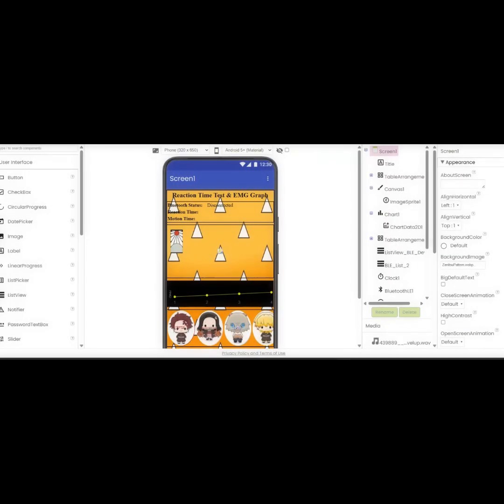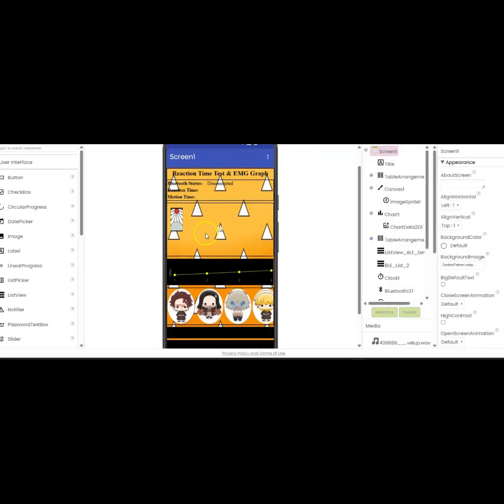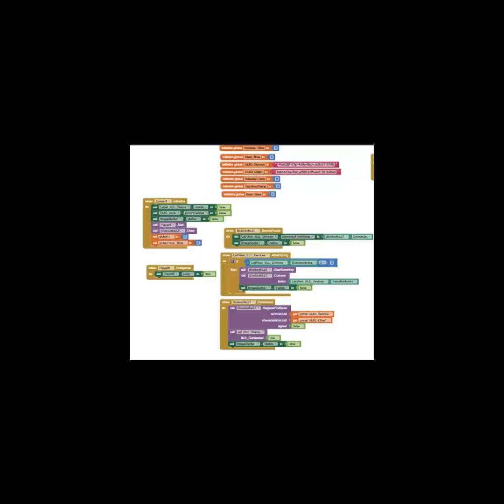This is our MIT app code. This is how the screen looks on the MIT app. And this is how the app looks once we connect it to a phone. And this is our block code. Here we have some global variables. These right here are for our reaction time test.